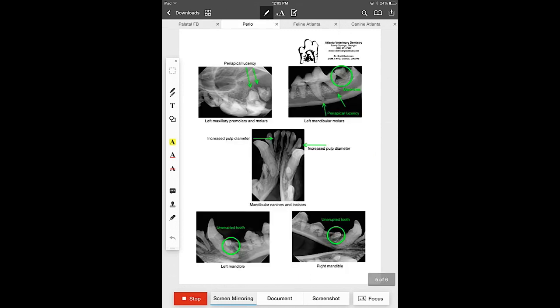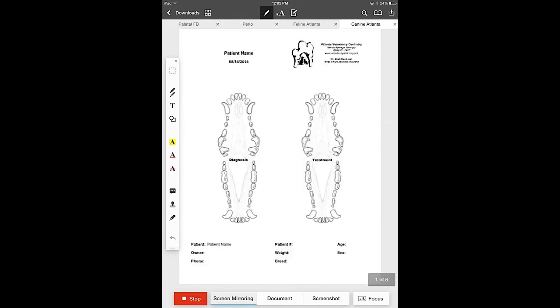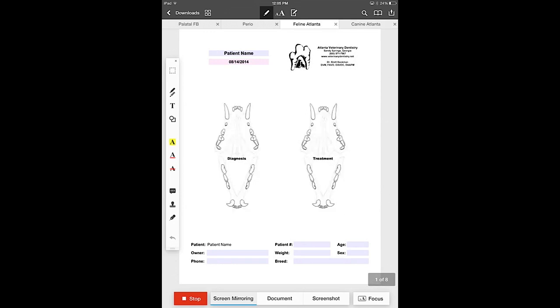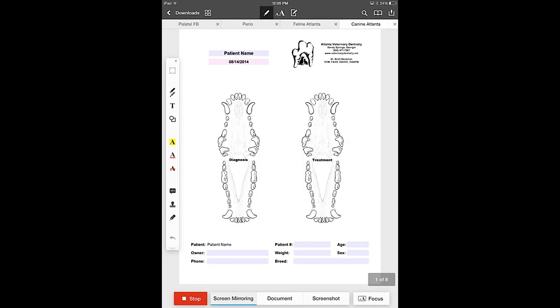We have both a canine and a feline version, both of which are available for veterinarians and specialists. So let's take a look at how we use the annotation bar on the left hand side of the screen to create a dental chart.